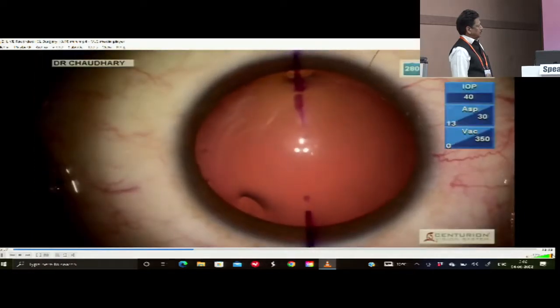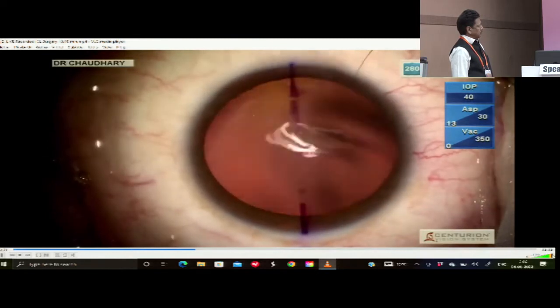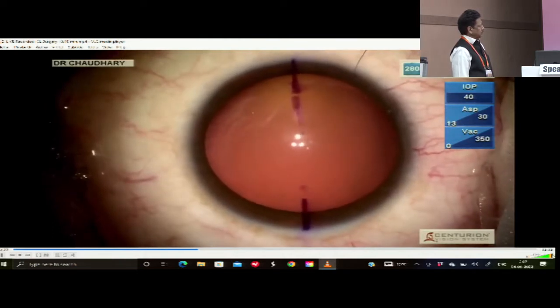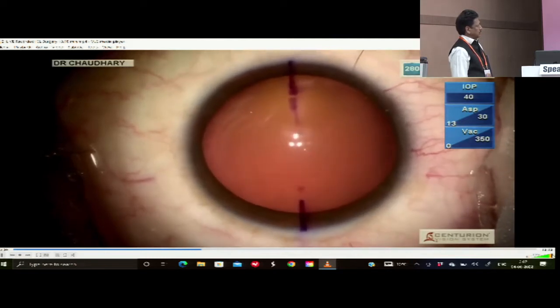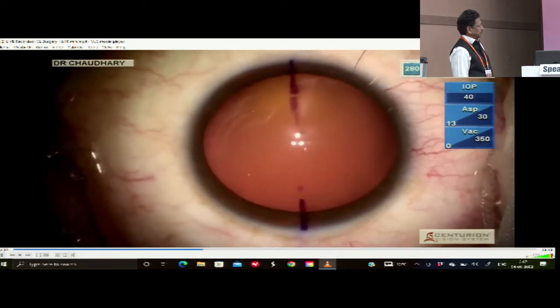Now there are two ways to develop your axis. You can go the manual way. The best way, if you have to go manual, is the axis reference marks of 0-180 on the slit lamp. But that takes a little time because you have to go from one machine and then to bring the patient to the table. Yeah, in Varion we don't need referral marking, correct?